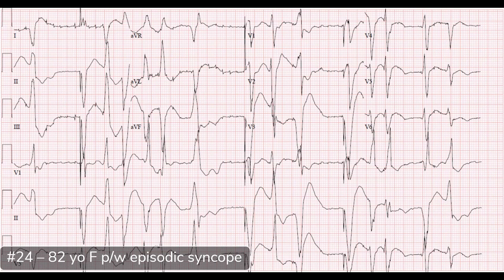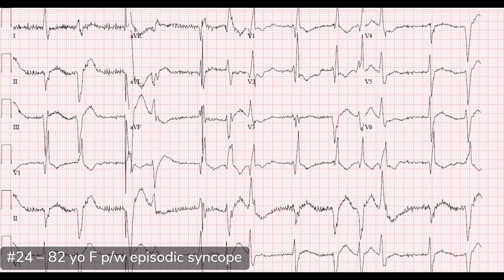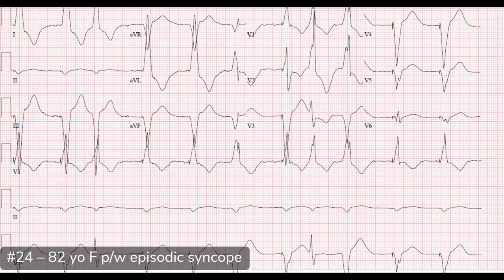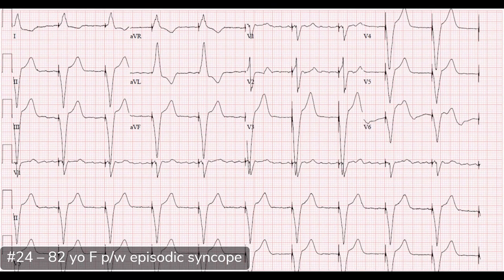Now cycling through some ECGs, you can see the evolution of what happened. After a little bit of replacement, you can start to see it normalize a little bit — a little bit more — and finally, when she was normokalemic, this is what it looked like.